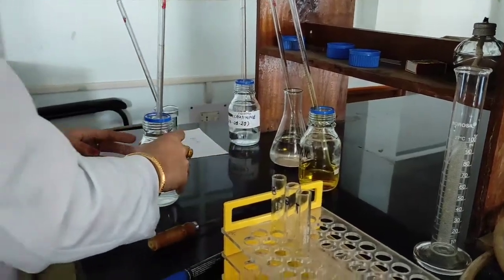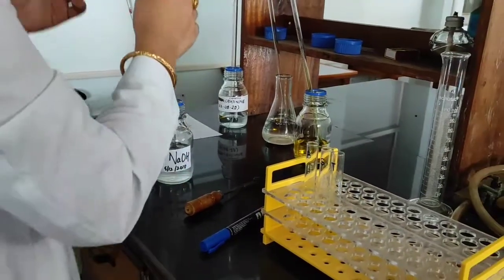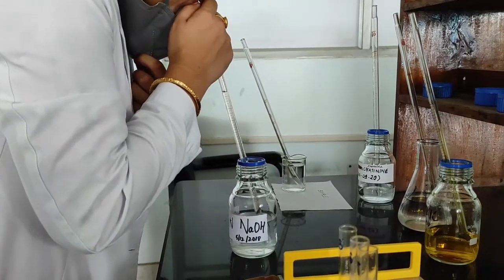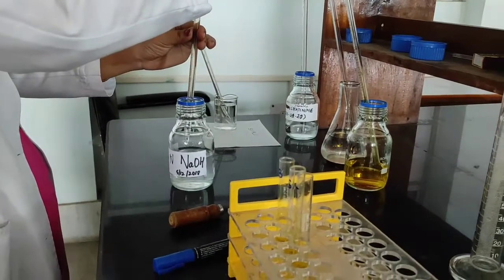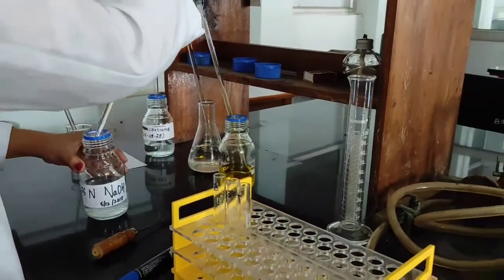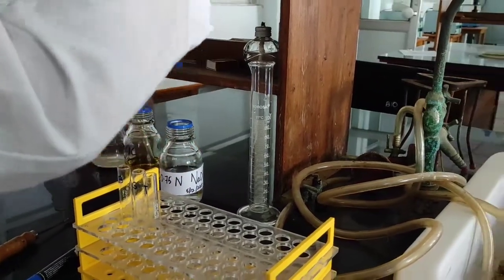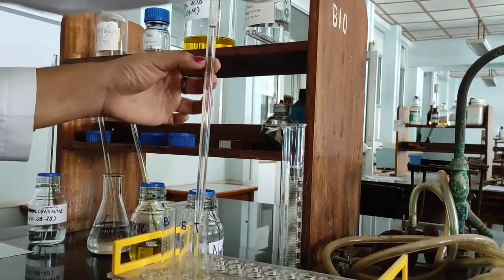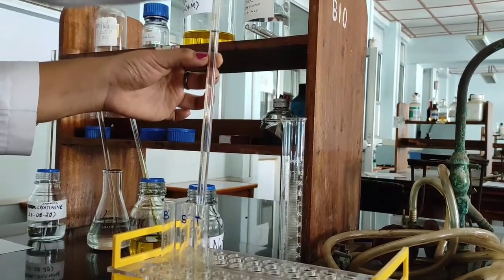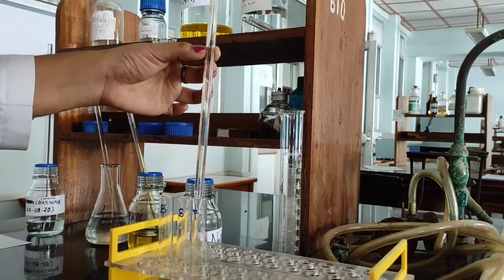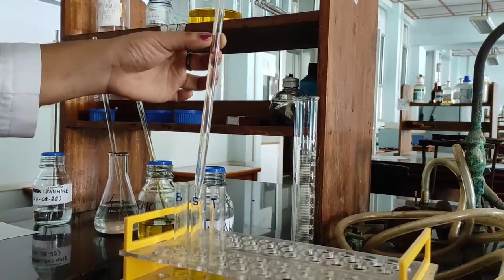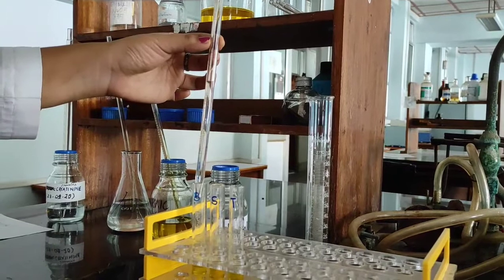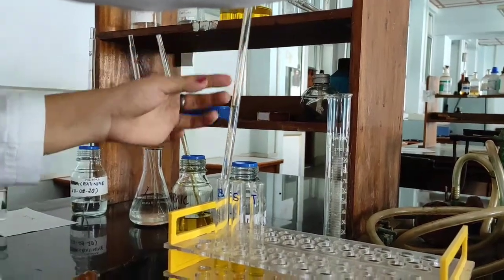And last is 0.75 normal sodium hydroxide. So this 0.75 normal sodium hydroxide, I'll be putting 1 ml in each of the test tubes. 1 ml in the test, 1 ml in the standard, 1 ml in the blank.